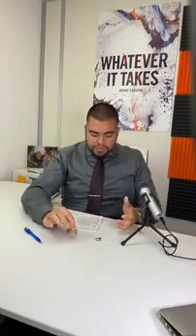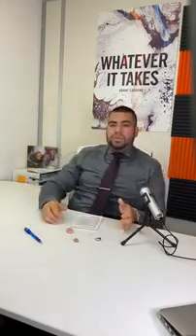Now, as far as the custom hearing aids, they're made out of a harder material, some type of acrylic. Whenever you get one made for yourself, we take an impression, which is basically a mold of your ear canal, and we send that to the manufacturer, and they design and make the hearing aid. I'm not saying this hearing aid is going to be uncomfortable, but it's made out of hard material, and I personally believe the soft silicone on the receiver in the canal style behind the ear is way more comfortable. So that's the materials and comfort of those two styles. Now let's get into the user controls.